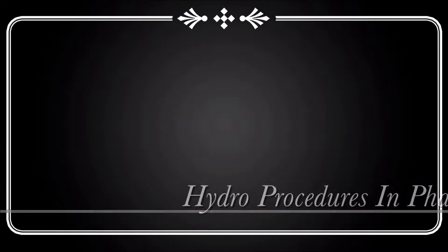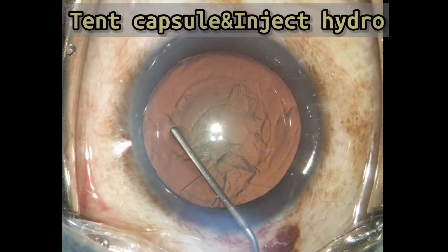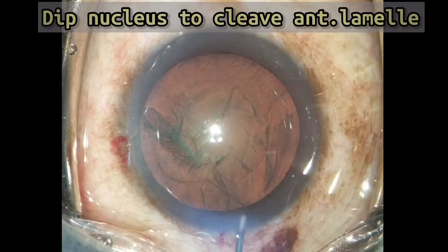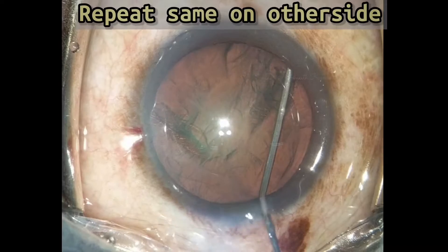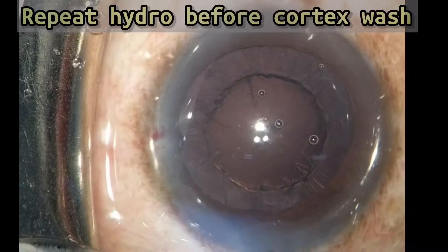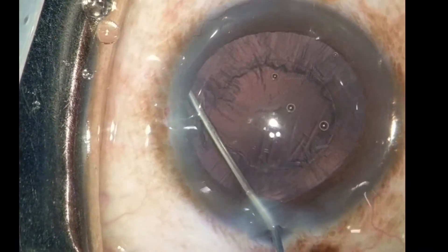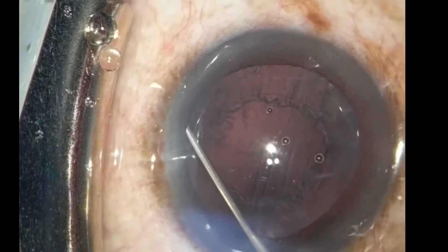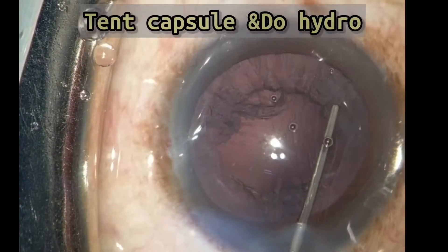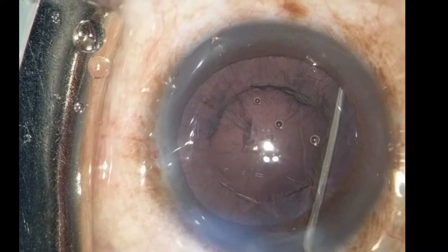In phaco, hydrodissection is performed by tenting the capsule and injecting the hydro wave, observing the wave passing below the nucleus, then dipping the nucleus. The same step is repeated — cortex wash and repetition of hydrodissection loosens the cortex. Again, tent the capsule, inject the hydro, and observe the wave passing through.